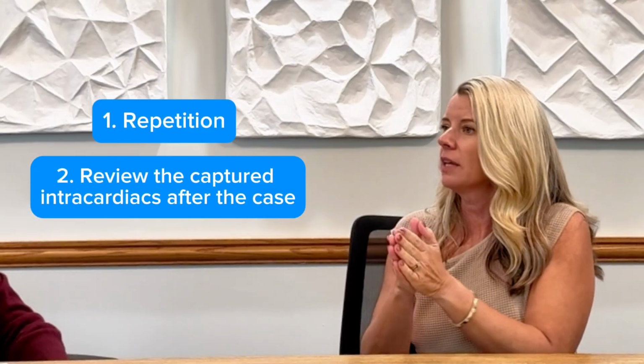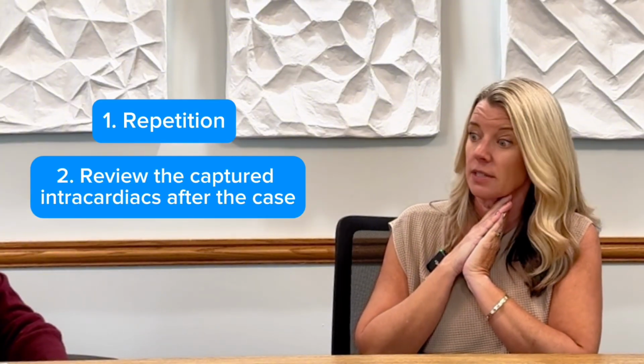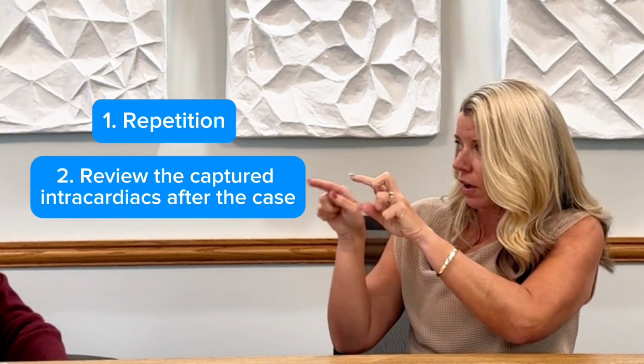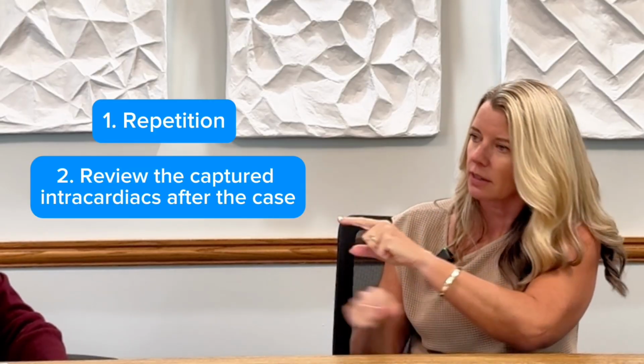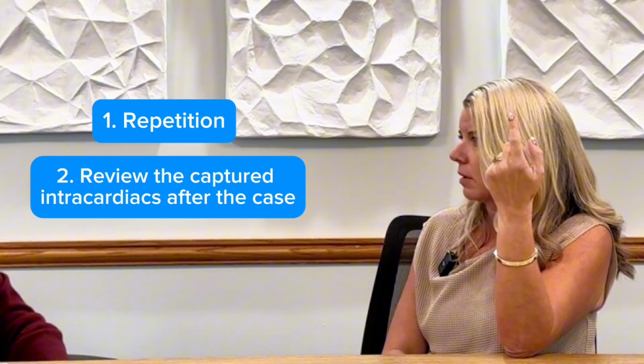But in the downtime between cases, if you have that, you can replay all of the recordings. In the lab that I started in we didn't have that. Literally our next patient was in the hallway and we still had to get this one out. But you can reopen the study, run, and look at that.